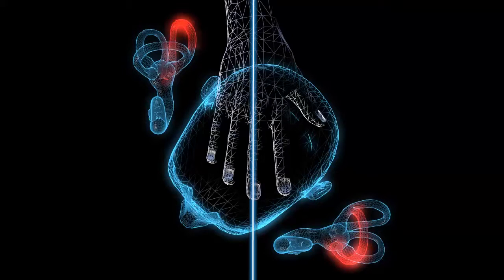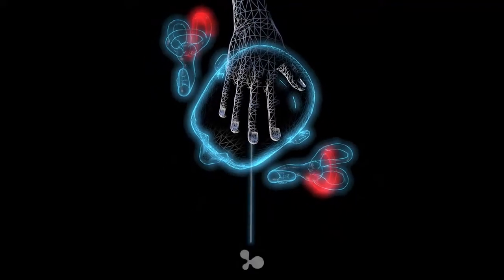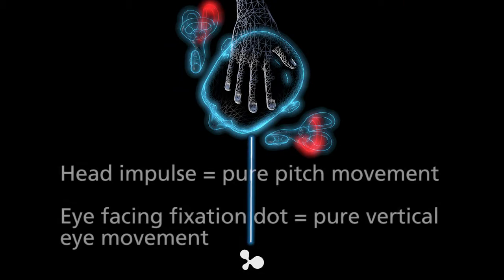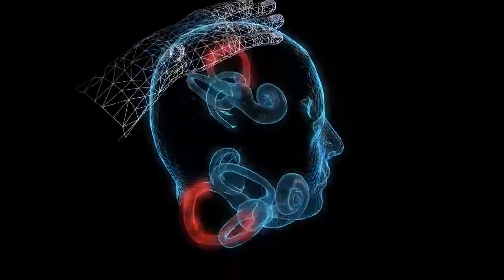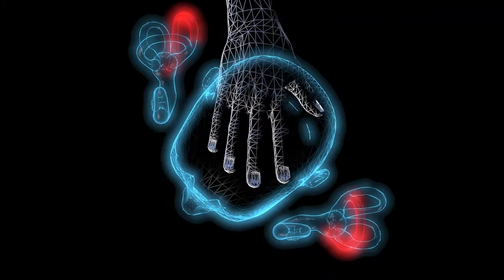Even though we're moving the head 35 to 45 degrees to the right, we have the patient look back at the fixation dot and not towards their nose. The reason is that the eye movement is then pure vertical and not a combination of vertical and torsional. When measuring torsional eye movement, you need a slower frame rate to pick up the torsional component. We are using 250 Hz to pick up catch-up saccades, so at this higher frame rate we cannot measure the torsional component. Any torsional component could also affect your gain, so make sure the patient is still staring back at the fixation dot.